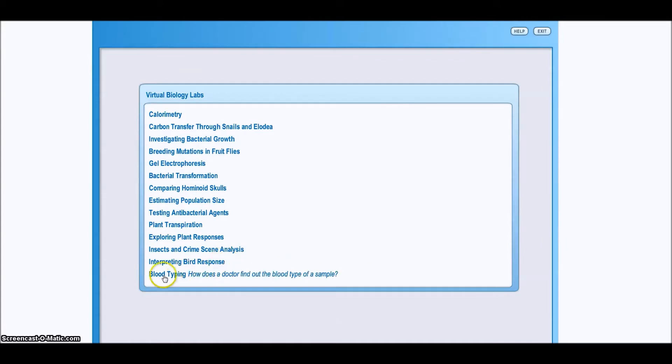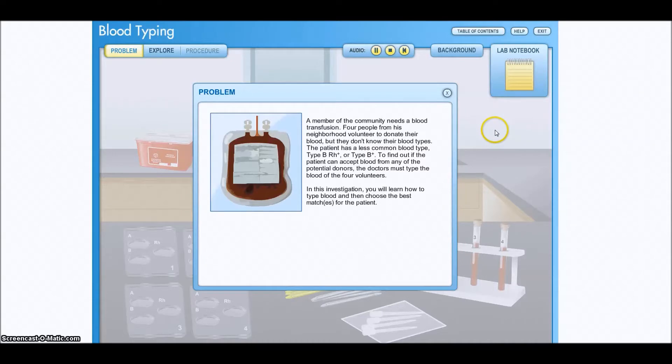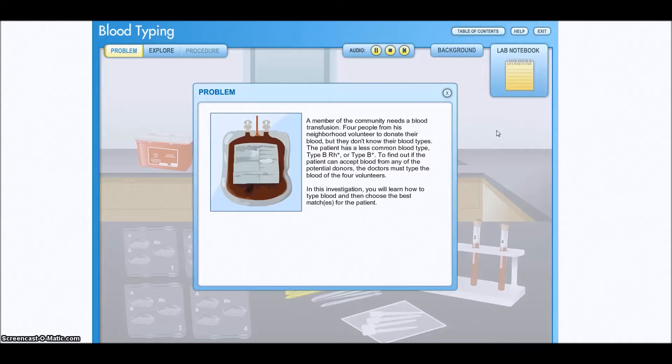I'm going to go to the bottom and click on blood type. A member of the community needs a blood transfusion. Four people from his neighborhood volunteer to donate their blood, but they don't know their blood types.